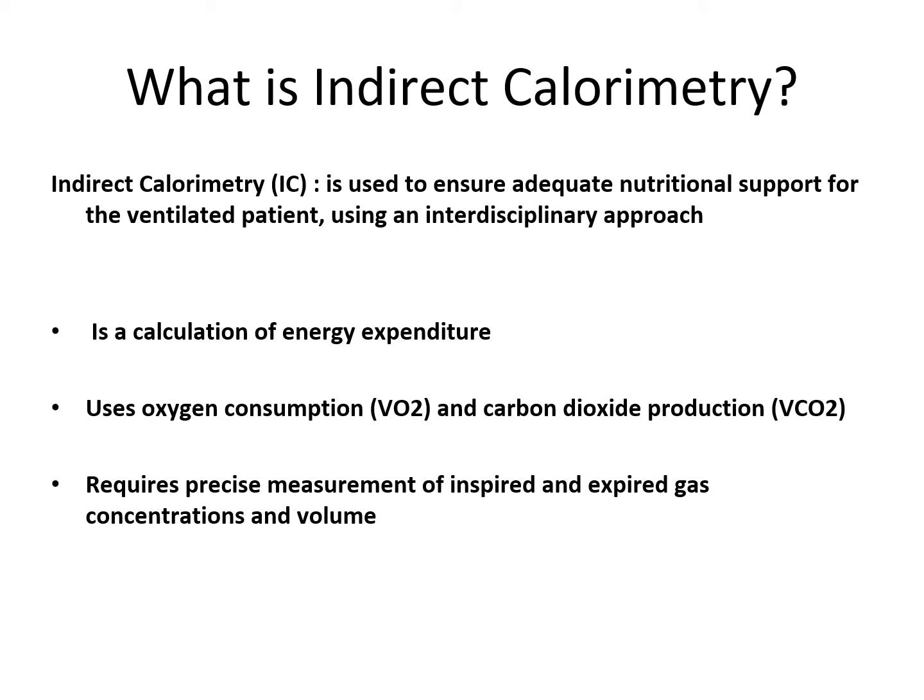It's a calculation of energy expenditure. It basically uses oxygen consumption and carbon dioxide production, and it requires very precise measurements of inspired and expired gases.